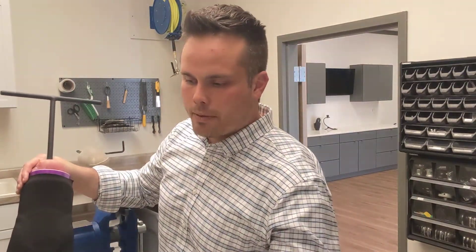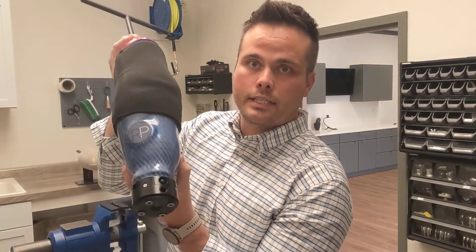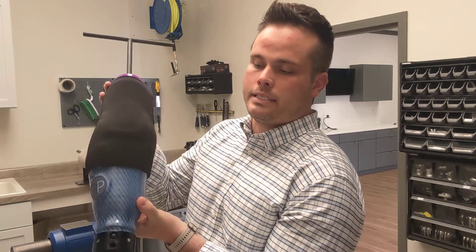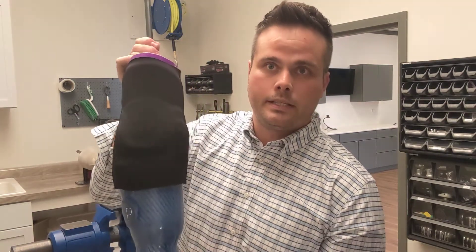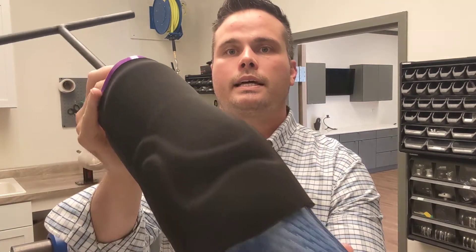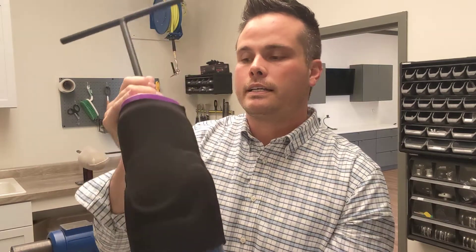Lastly, we have vacuum. In this case, vacuum is achieved by a Limb Logic electronic vacuum pump. There are also Harmony pumps that are mechanical. This electronic one requires you to charge it and physically press a button. Once you press that button, the air becomes evacuated from the socket — you can see the air being pulled and the trim lines becoming more defined. The advantage of the electronic pump is that it's always managing the air pressure inside your socket, whereas a mechanical pump requires a force to be applied to draw the air out of the socket.